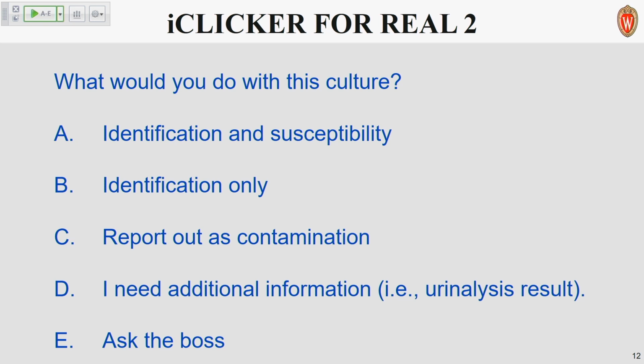We actually worked on a project with urology. They have 2 separate orders they can order. They can order the one where we work everything up for them if it's a pre-surgical, or they can just order a routine that we work up like any other routine. So it's essentially a pre-surgical requisition versus a routine requisition. Just a question to Gina: would you just give identifications only, or would you do sensitivities for everything as well? Okay, thank you. Keep it up.